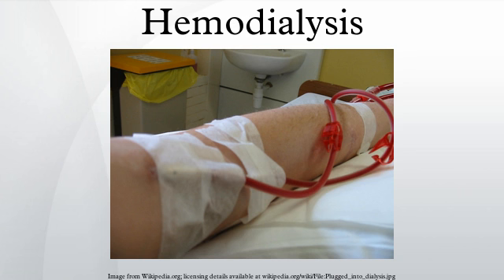Principle. The principle of hemodialysis is the same as other methods of dialysis. It involves diffusion of solutes across a semi-permeable membrane. Hemodialysis utilizes counter-current flow, where the dialysate is flowing in the opposite direction to blood flow in the extracorporeal circuit. Counter-current flow maintains the concentration gradient across the membrane at a maximum and increases the efficiency of the dialysis. Fluid removal is achieved by altering the hydrostatic pressure of the dialysate compartment, causing free water and some dissolved solutes to move across the membrane along a created pressure gradient.